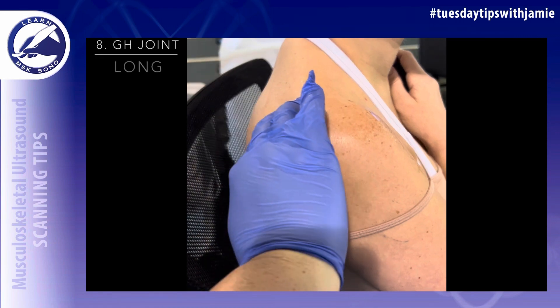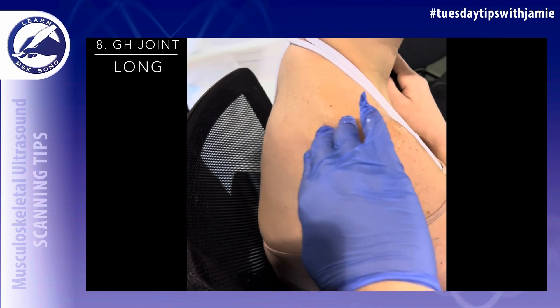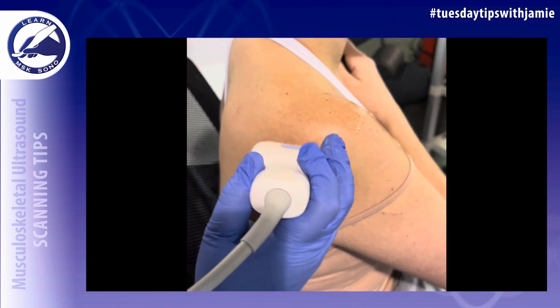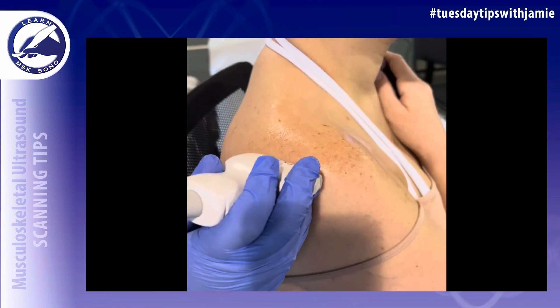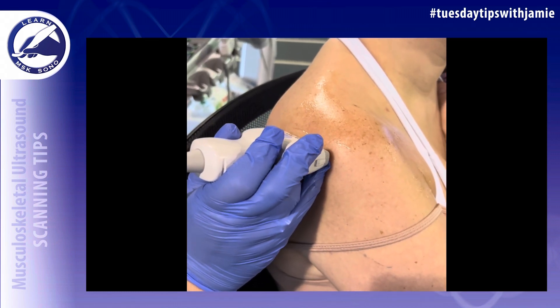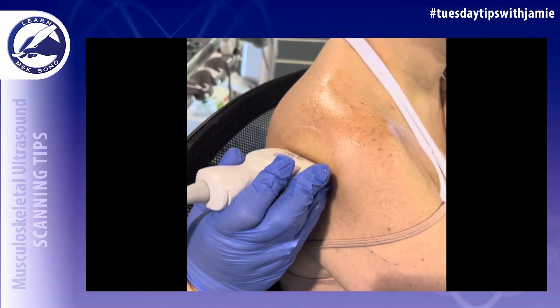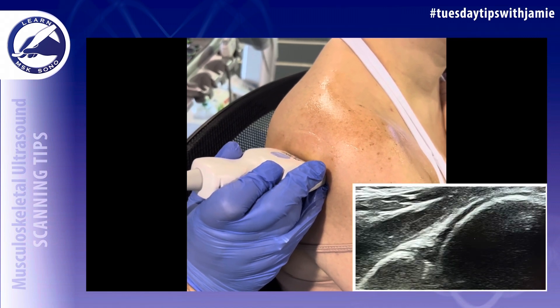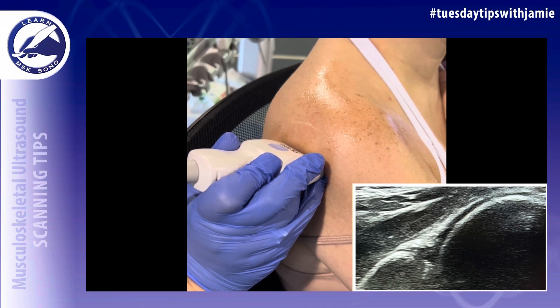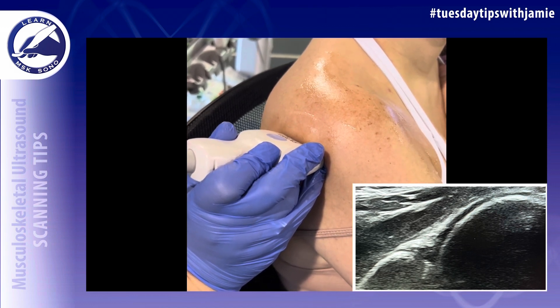Palpate the scapular spine on the patient's body and come to the lateral edge. Place the transducer long axis to the scapular spine at the lateral edge and move slightly inferior to locate the glenohumeral joint. Capture an image of the glenohumeral joint in the long axis with grayscale and with power Doppler.